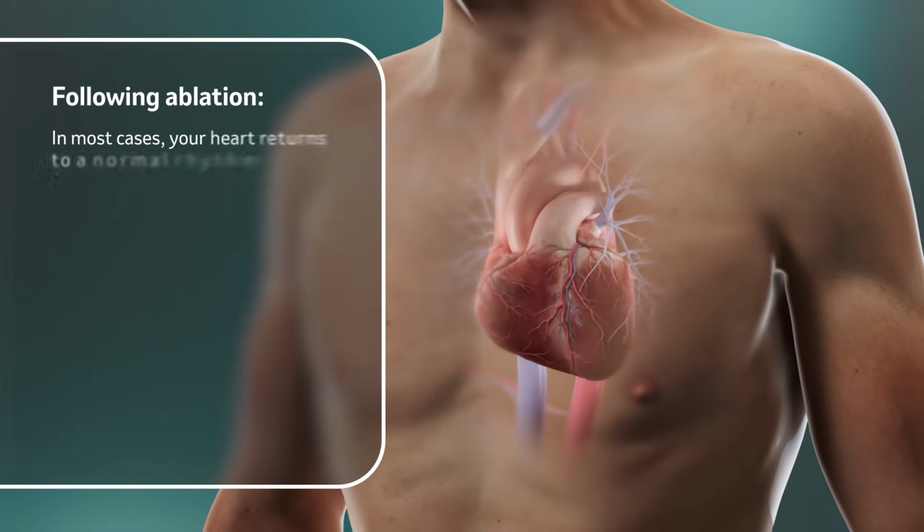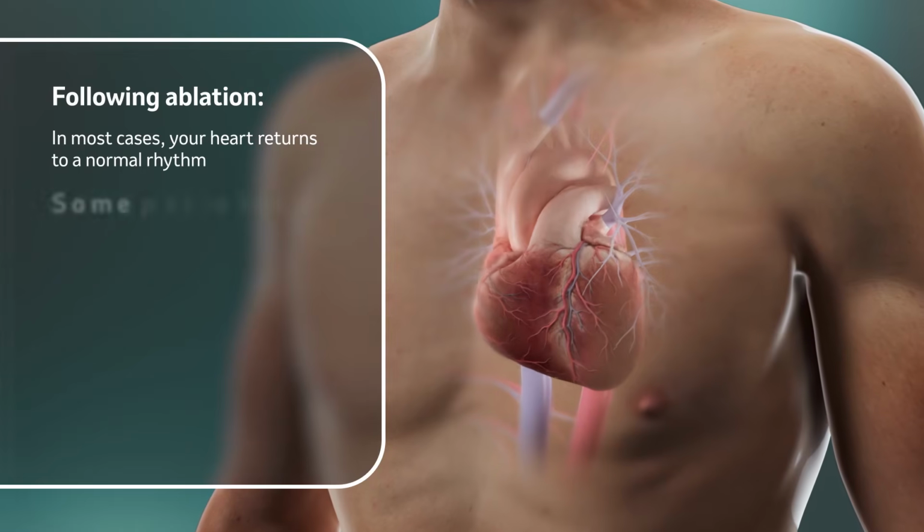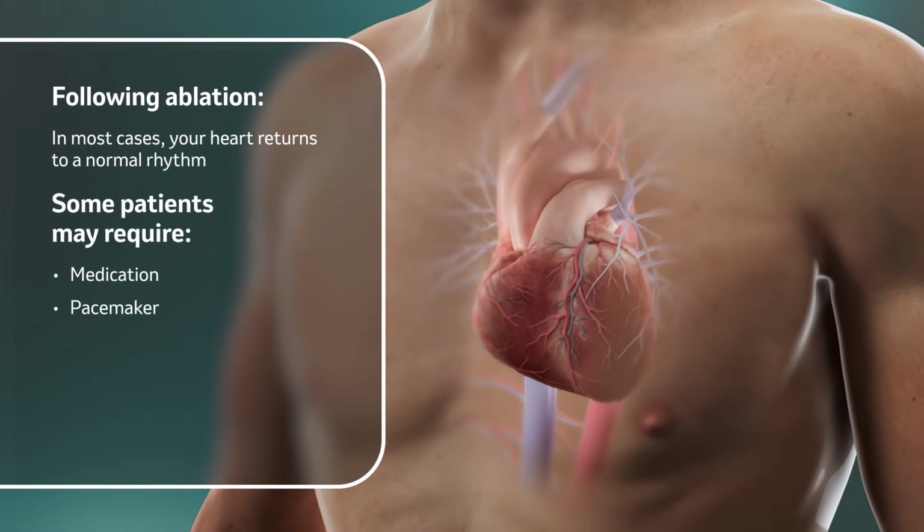In most cases, your heart returns to a normal rhythm following ablation. Some patients may require medication or a pacemaker to maintain a regular rhythm.